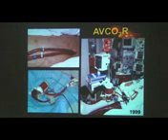This way the things have been done. It's an arterial and venous cannula. Basically the blood goes through the oxygenator and it comes back, returning. Okay, this is the way it has been done. This is the gas exchanger, and it's going to be a very low resistance gas exchanger.